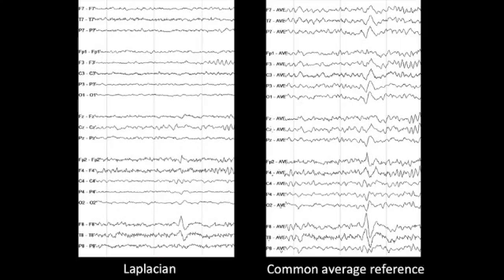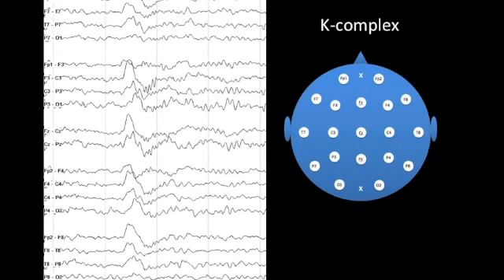You can see here on the left the Laplacian montage, and on the right the common average reference montage, with reference contamination, seen best in the left hemisphere. The Laplacian montage has some limitations, especially with very broadly distributed electrical discharges.